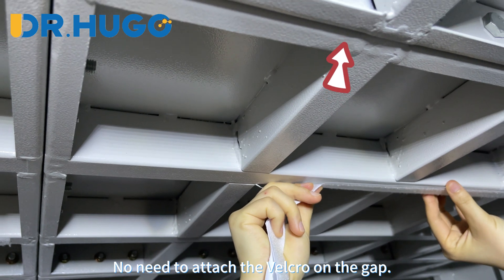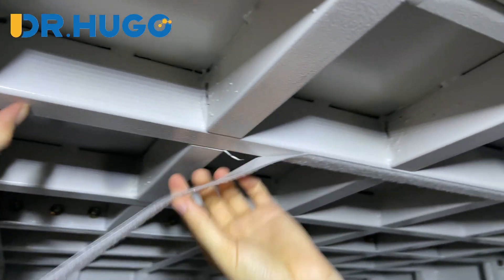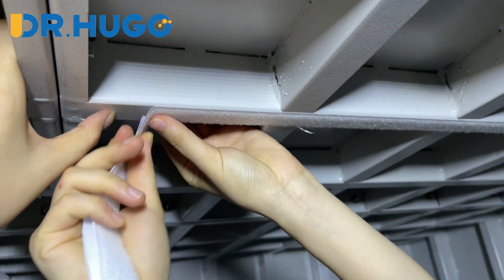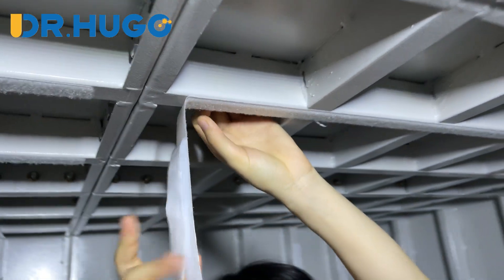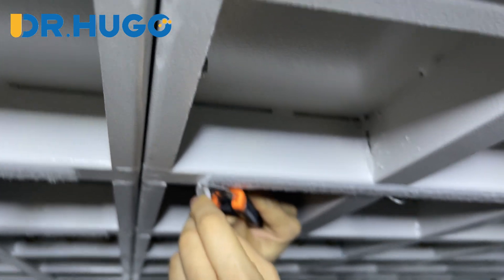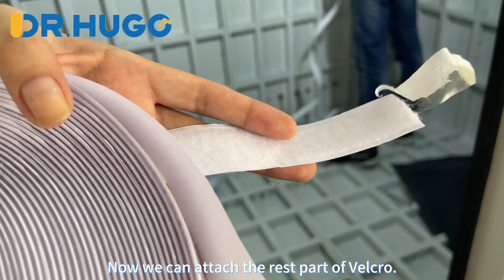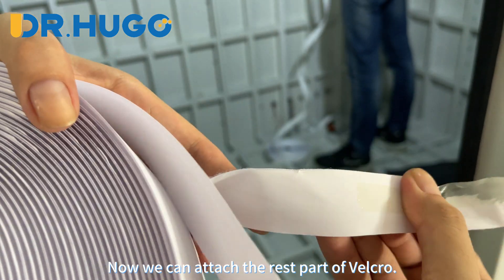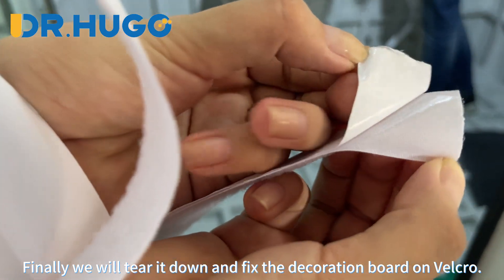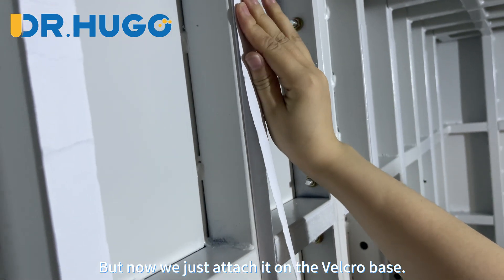No need to attach the velcro on the gap. Keep 5 cm distance to the edge. Now we can attach the rest part of the velcro. Finally we will tear it down and fix the decoration board on the velcro — But now we just attach it on the velcro base, but the board will be placed on the back to look well.